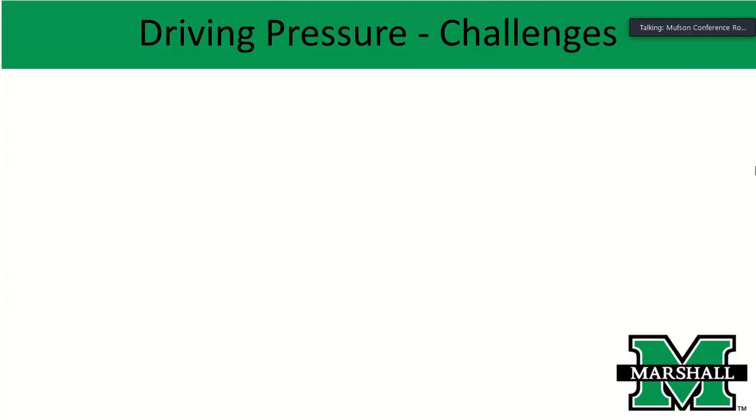What can you try to do to make it below 15? I will start with the tidal volume actually. Exactly. You will drop the tidal volume and remeasure the plateau. Exactly. Okay? But we don't know how to implement that optimally. First of all, higher driving pressures are associated with worse outcomes. We know that. There's a lot of studies on that. But keep this in mind, this is a question that I would ask.